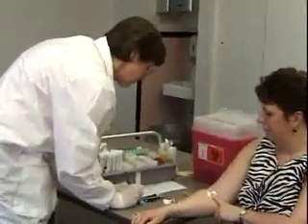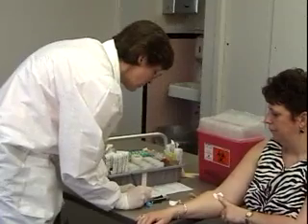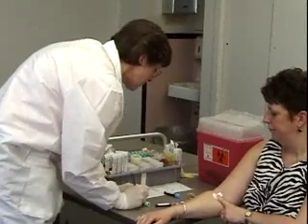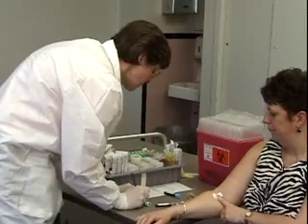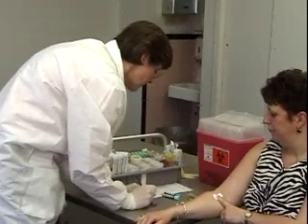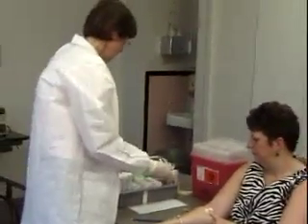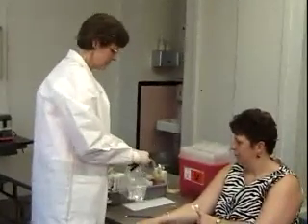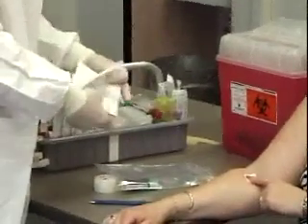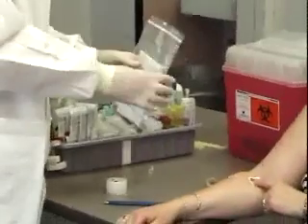You want to make sure that you label the tubes with the appropriate name and history number. I'm going to write Mrs. Smith's name and history number — Alice Smith, 756423 — on each tube. Then I'm going to put the blood in a Ziploc bag, and in the pocket of the bag you want to insert the request form, and you would send this to the laboratory.